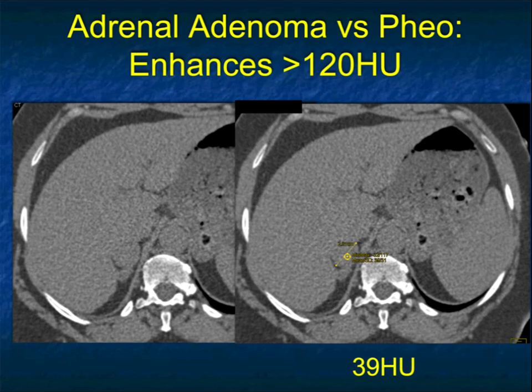Now, what I'll do in this part of the talk, we did a lot of facts in the first part of this talk, and in this part, I'm going to show you a lot of classic pheochromocytomas and what I would call the less than classic pheochromocytomas.